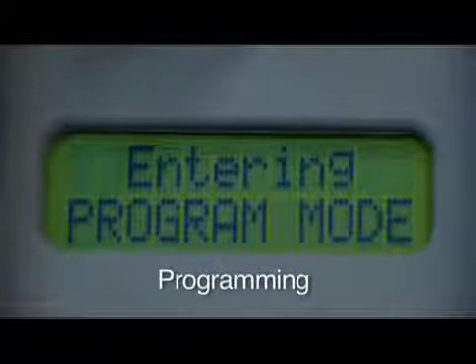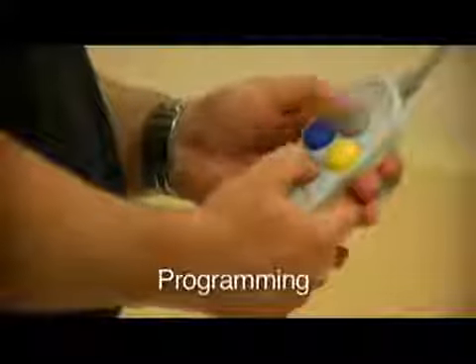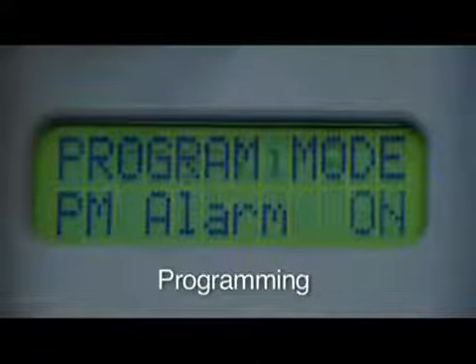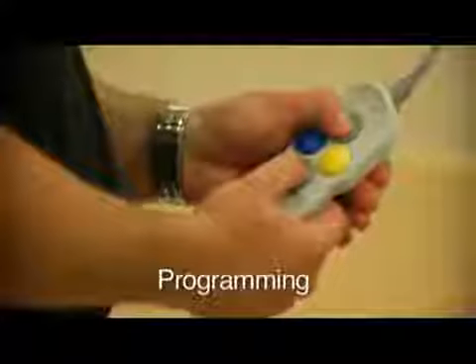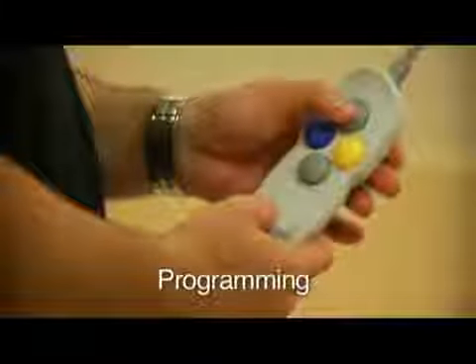To enter into programming mode, press the up and down button simultaneously. Use the up or down arrow to review your options, and then to save a change, press the up and down arrows at the same time. The unit will beep if the change is accepted, then it will go back to the main programming screen.